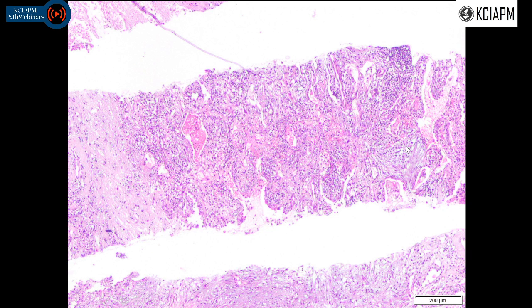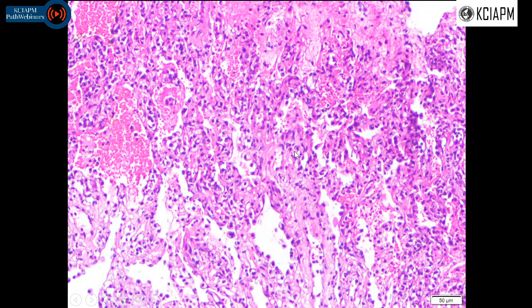You have fibroblastic proliferation with epithelialization at the periphery, this granulation tissue, there's some edema. Going higher on to this, there's some bit of hemorrhage, there's lot of inflammation. So it looks like an inflammatory lesion in a patient who was suspected to have a mass in the lung.